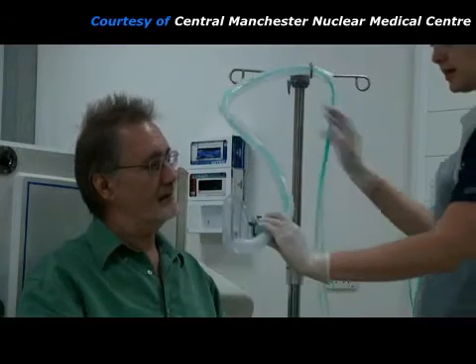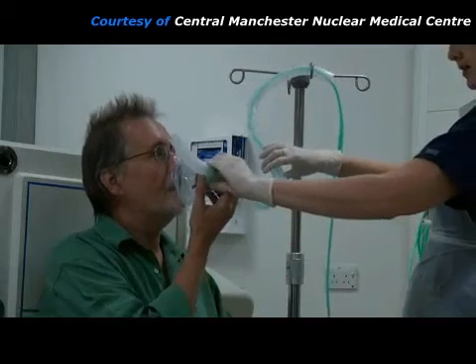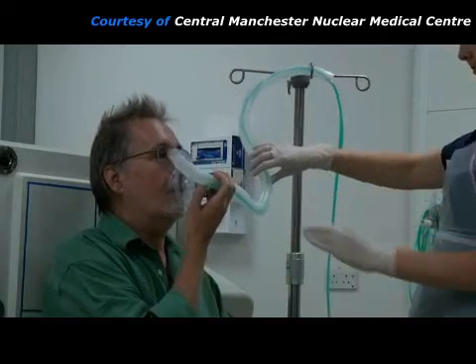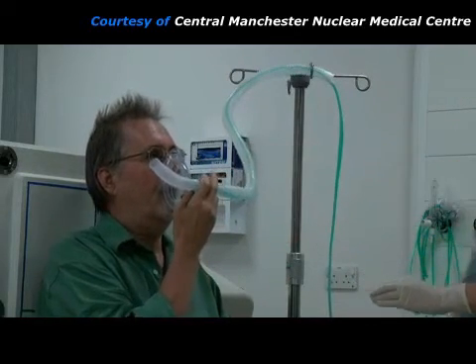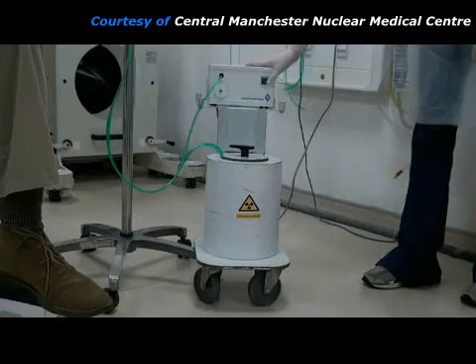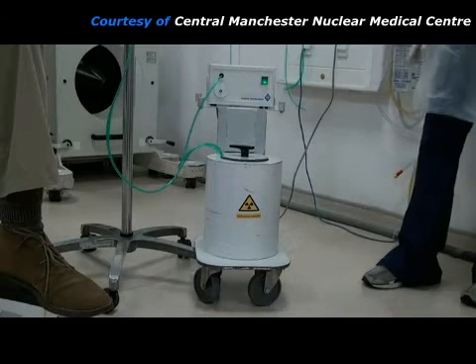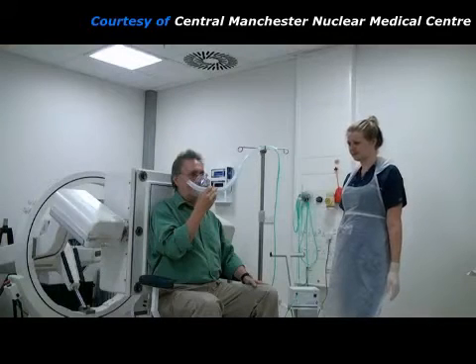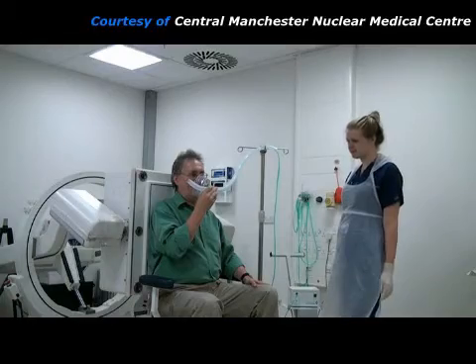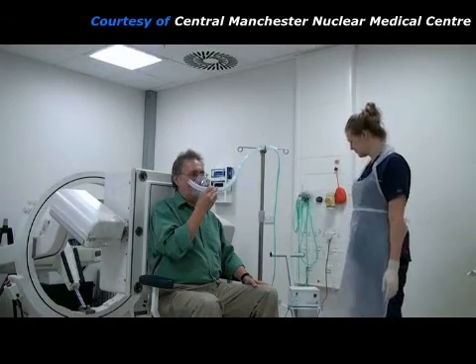Now the patient puts on a face mask. This is connected to a generator that adds a small amount of radioactive gas to the air that he is breathing. The camera can take a picture showing air flow to the lungs. This is the posterior ventilation picture.